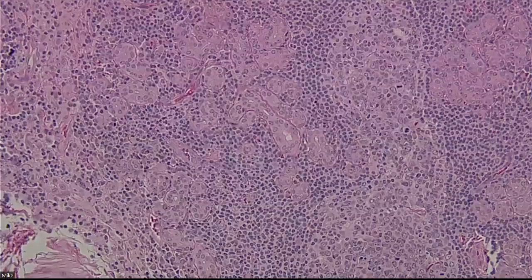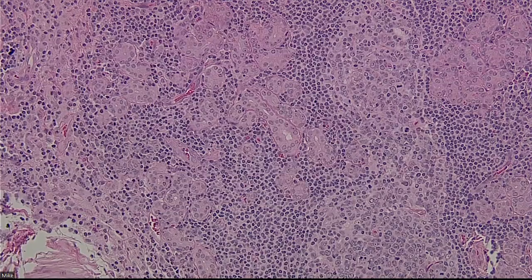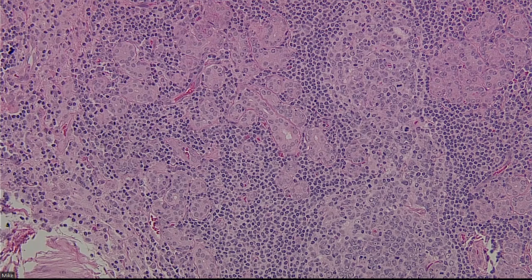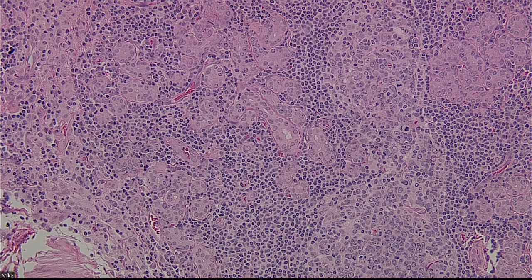I remember seeing a case of ranula in one of the... Ranula? Ranula, yeah. We would have to see the extravasated mucin. Yeah, so a ranula or a mucocele is a process of extravasated mucin, and often with mucophages or macrophages. What makes a ranula different from a mucocele?